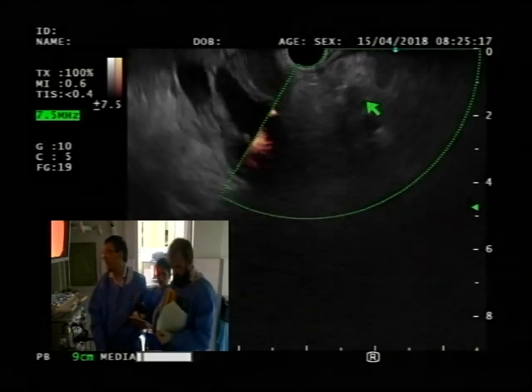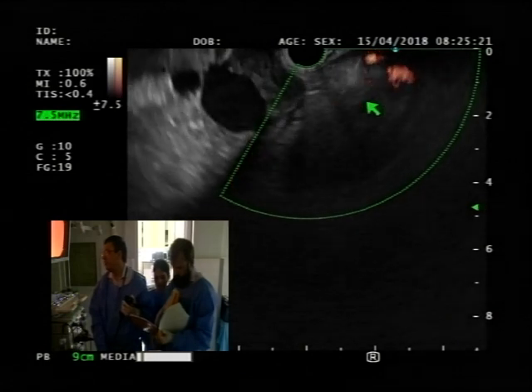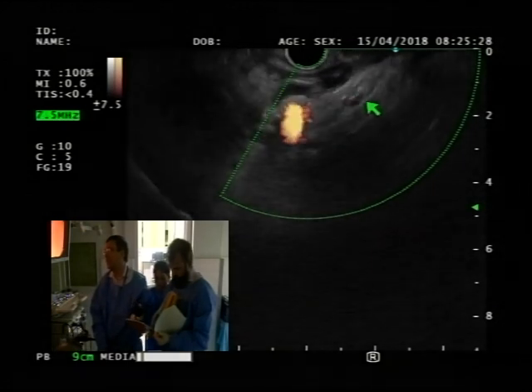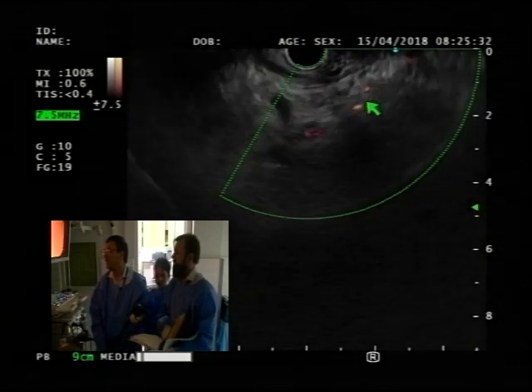Khalid, just for the sake of completion, can we have a look at the body of the pancreas again, please? There is no body, actually. We didn't really see any body. You don't see anything. There was no body there. I'm pretty convinced this is what they must have seen, and they thought this is the body.